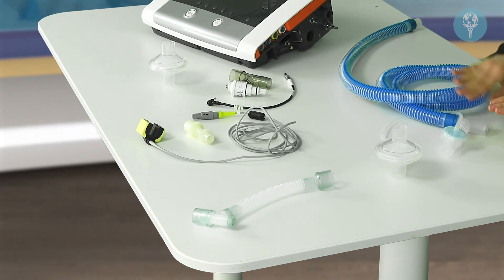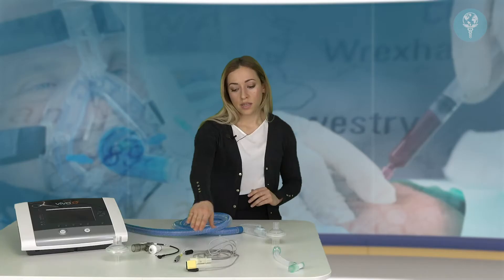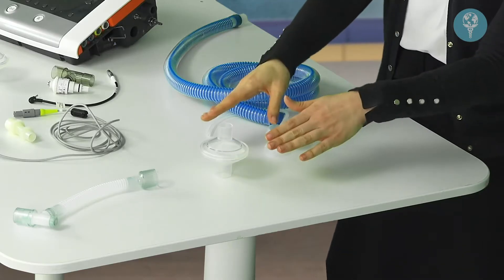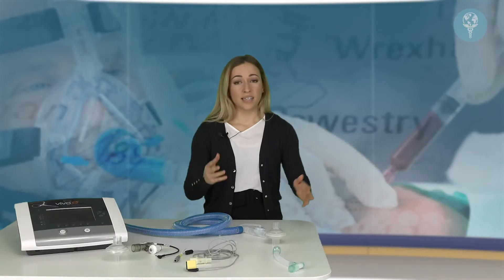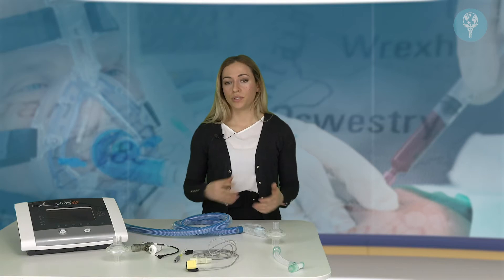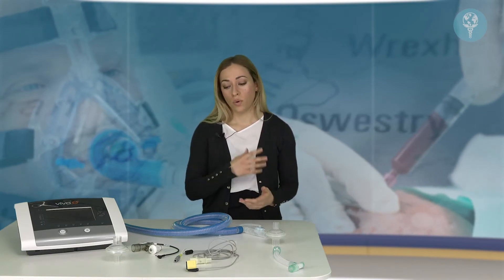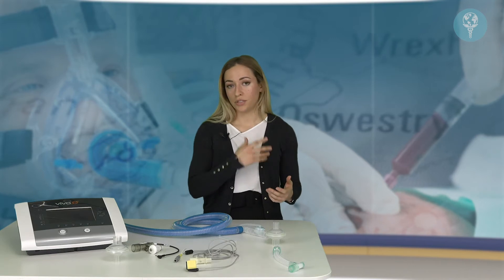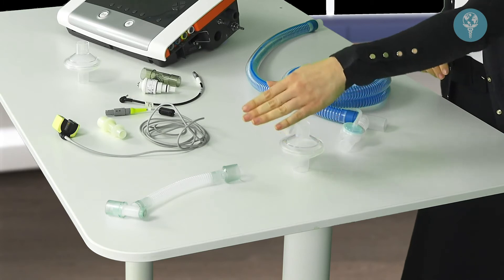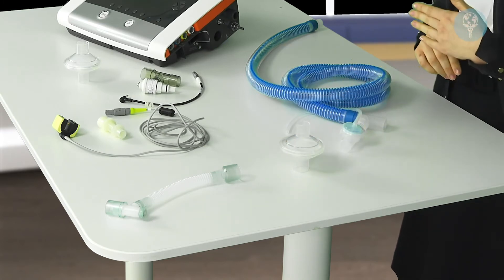At the other end of the circuit we have the end tidal CO2 monitor, which monitors the CO2 from the patient's breath. Following that we have another antibacterial filter. As standard you would generally only have one antibacterial filter in a patient circuit, but during the COVID-19 pandemic we advocate using two — one protecting the air going to the patient and one protecting the air coming from the patient. Then we have the catheter mount, which connects from the antibacterial filter to the endotracheal tube.